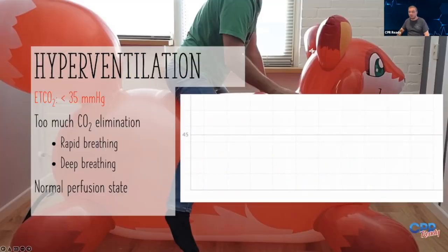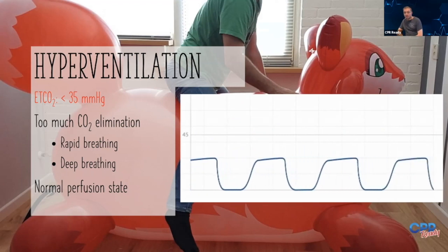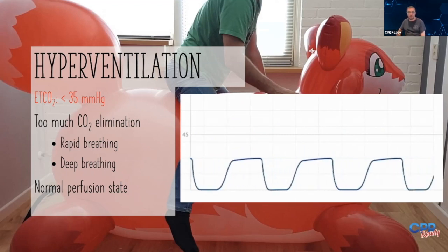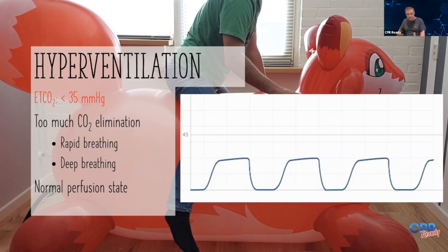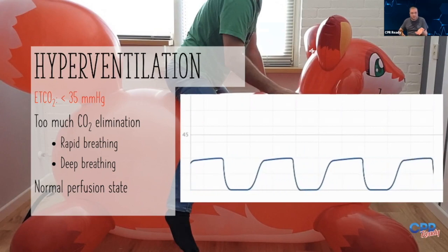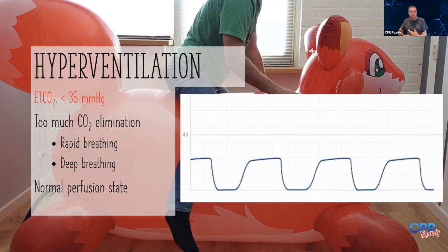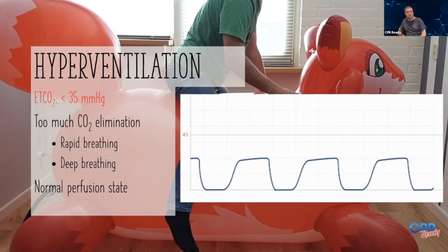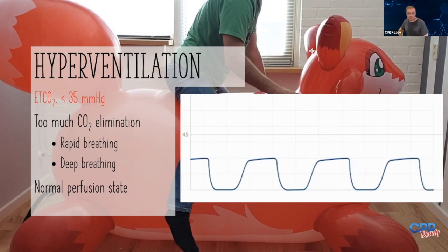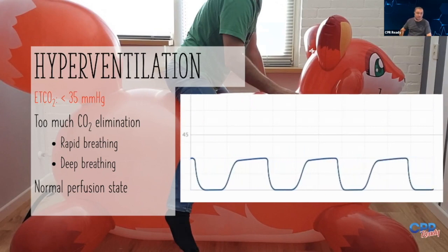Hyperventilation is the opposite end of the spectrum, right? This is caused by either too rapid of a breath rate or by deep breathing, which means larger tidal volumes. So think about it: if moving less air lets CO2 build up in the lungs, which will raise that number, then moving too much air gets rid of the CO2 too quickly, and that number gets low. So hyperventilation is going to show up as a low end-tidal CO2, or a number that's less than 35.